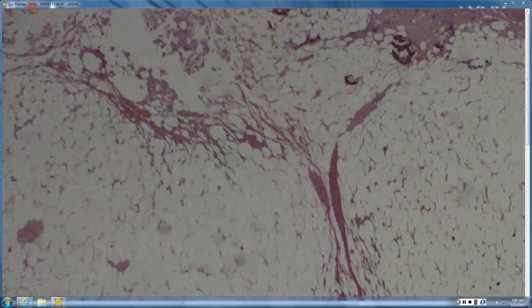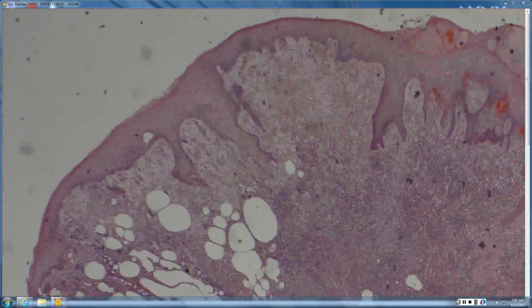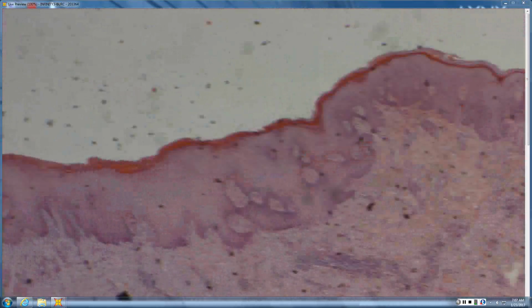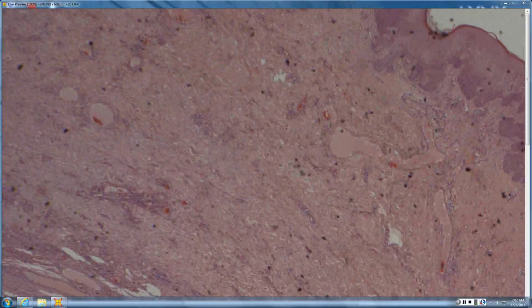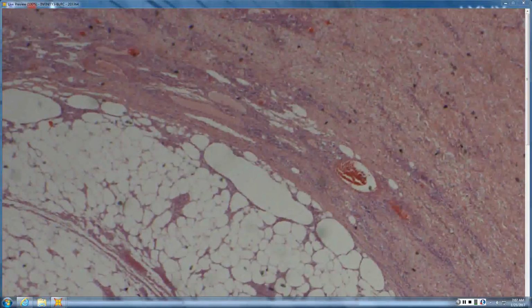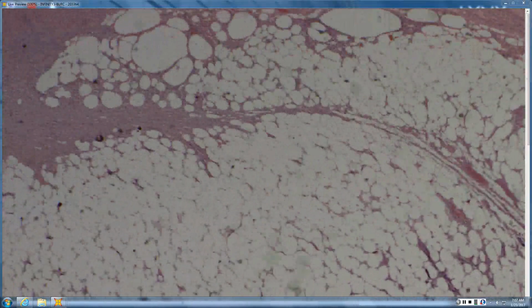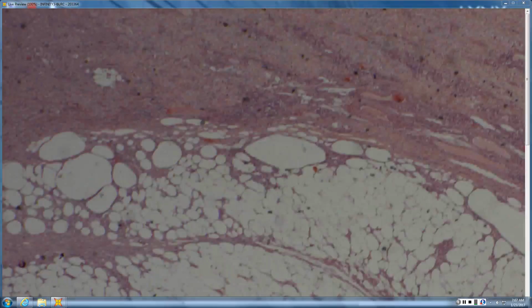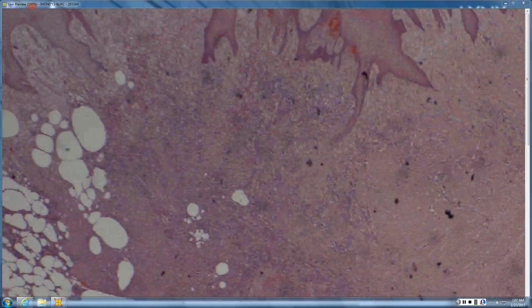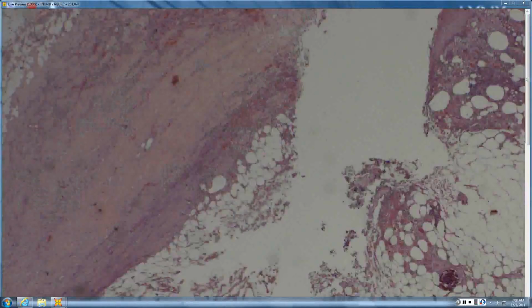But we get this request a lot, because in the hospital you get somebody that has retiform purpura, and they have a history of renal disease and a high calcium phos product, and they want to know, is it calciphylaxis? It can be hard to make a diagnosis based on a punch biopsy, because as you can see here, if you've just gotten a little 4mm punch, you might have gotten lucky and gotten it, but you also might have missed it. So this one clearly was done by a surgeon for a bigger chunk of tissue, which sometimes happens, but not usually. Okay.